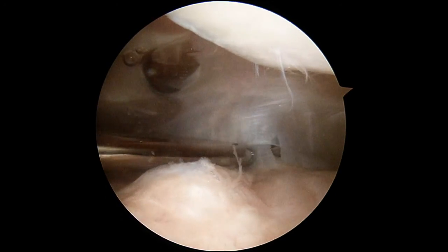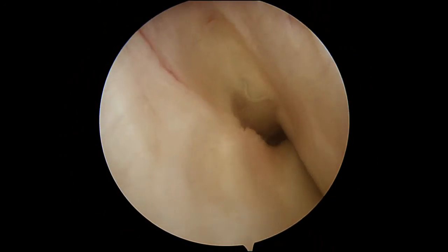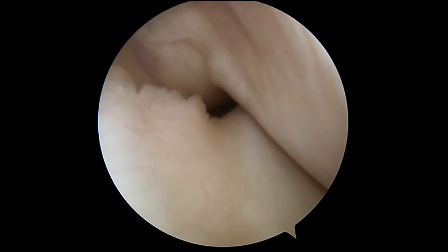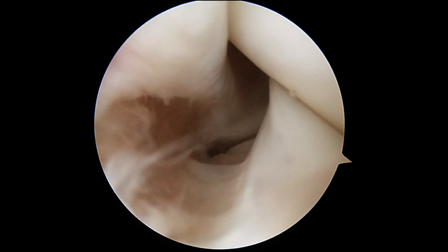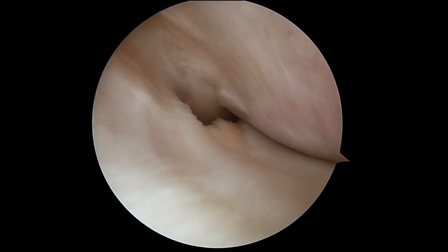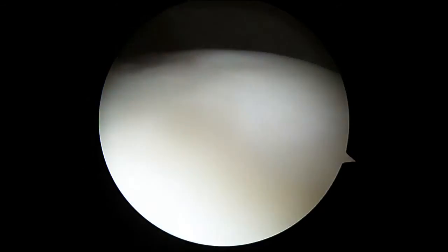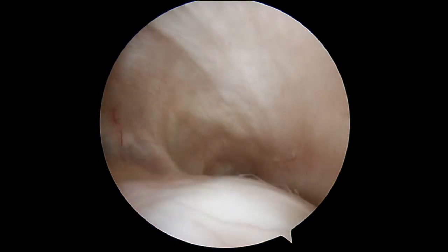Now I'm looking down in the outside part of your knee, it's called the lateral gutter. That's a normal little tendon in the knee called the popliteus tendon — looks very normal. That white edge there is where the lateral meniscus, or outside cartilage, is, and that looks perfectly normal.